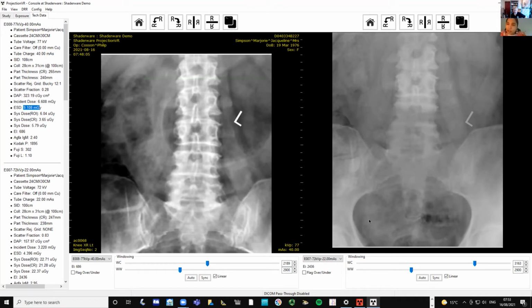Right. But is this online, or will this work offline? What happens is that you have it locally installed, but when it runs, it calls home to find out whether there's a license available. So you need the license server to be accessible. Any computer that it's running on needs to have access to the network just to get the license server acknowledgement.